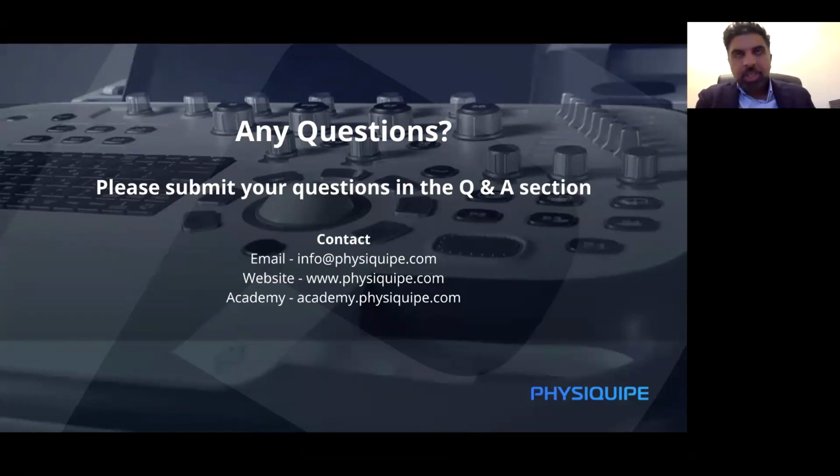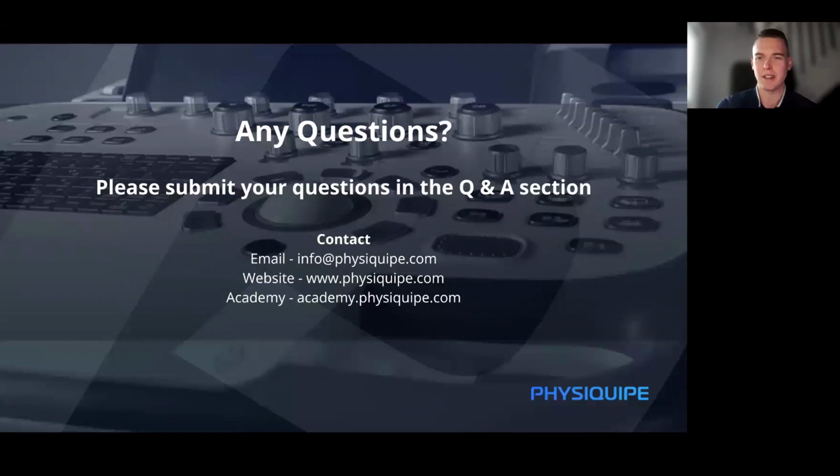But it does also make a lot of sense to me from a clinical point of view. For example, if someone has polymyalgia rheumatica of their shoulders, I could just inject blindly, but if I do the ultrasound and it shows that someone's got a bit of bursitis, and I direct that injection directly into that area of bursa, to me, that's a lot better than giving a general injection throughout the joint. Yeah, I agree. There's definitely value to ultrasound guided injections, isn't there?